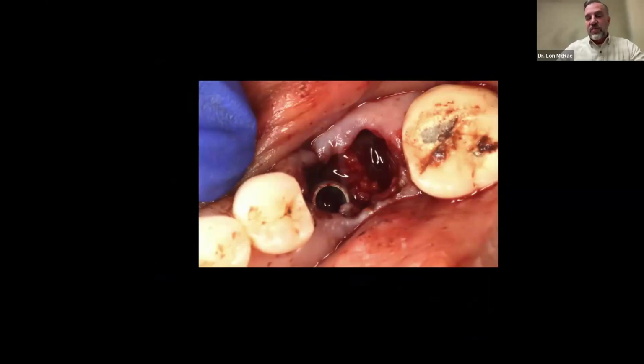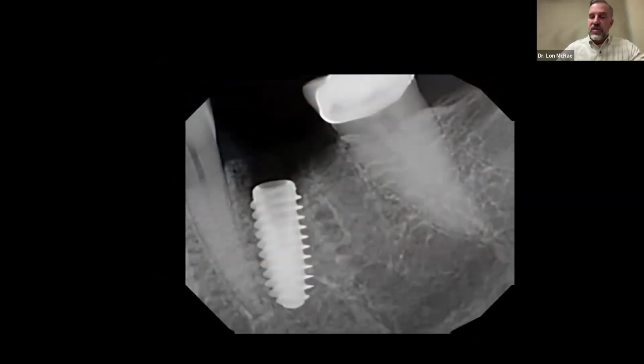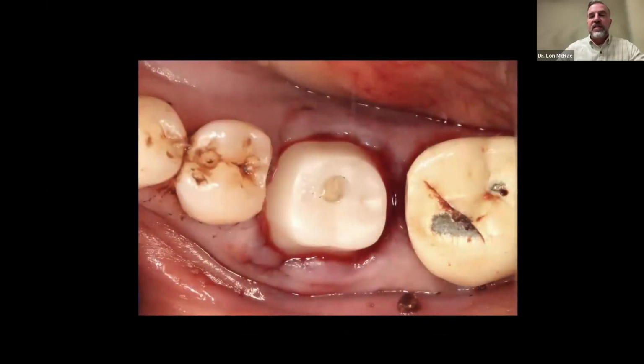So here is the implant placement. Again, we're in the mesial root. Some people will say we're too close to tooth number 20, and I agree. We could have possibly brought that a little bit more distally. I think it might be just the way the angulation is, but we want to be angled towards the central fossa of tooth number 19. So we do a bone graft all the way around that, and then we place our final abutment.